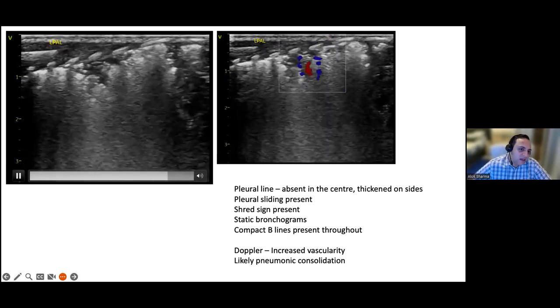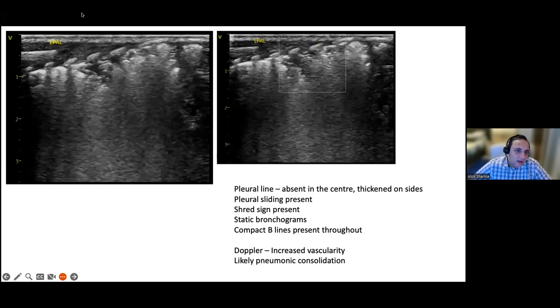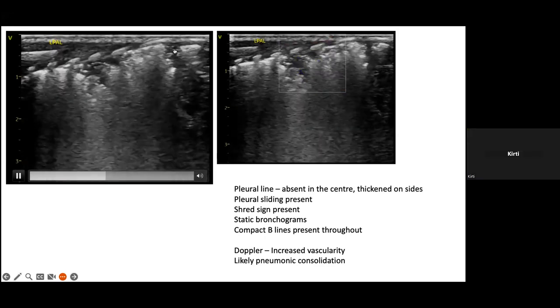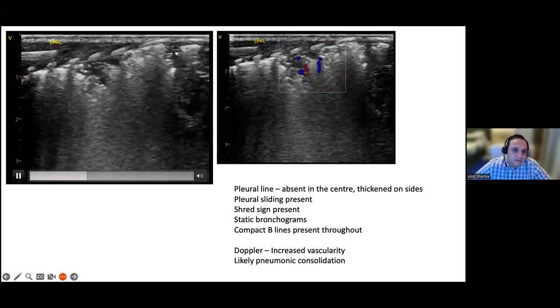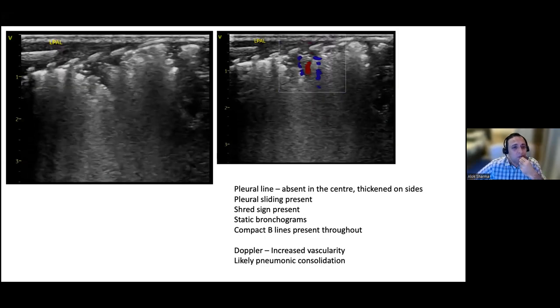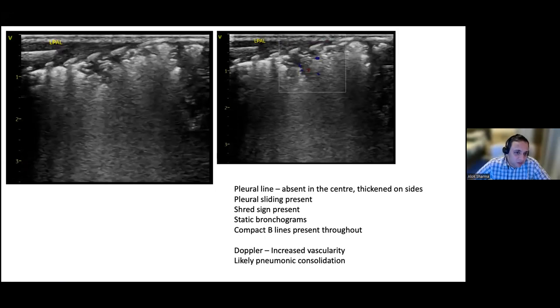Or what you could have is, it's the lower part of the lung, which could be a shred sign because your pleura is very irregular, right in the middle there. No, just lower down, lower down. Go to your right. Go further right. Okay. Yeah, there. Can you see? It starts over there. Now, the question is, is this just one area of lung that's completely rotten? Some kind of aeration on either side. So I would basically put a Doppler there and see. Okay. But very irregular margins. The question obviously is, because your pleura is abnormal, whether you have a deep consolidation, a deeper consolidation. So if you go down.